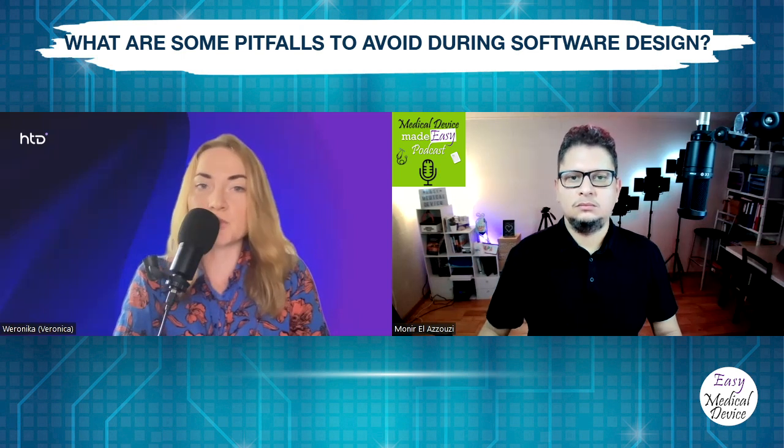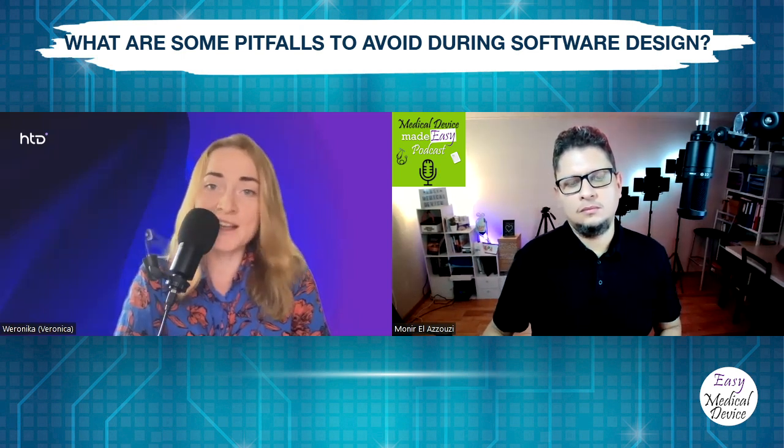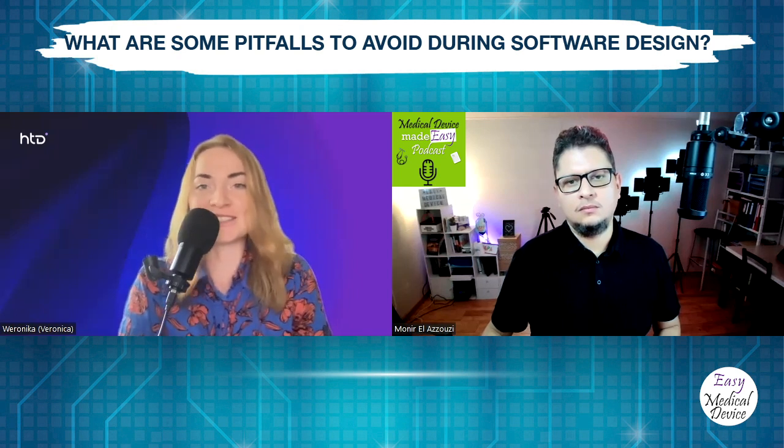Because when you're using agile, you can adapt to changes in user needs, because people change and user needs change, and regulatory and legal requirements change too. So the pitfall, which is not understanding how to use agile according to IEC 62304, is very important, because if you understand how to use it properly, it makes a whole difference for the whole product.